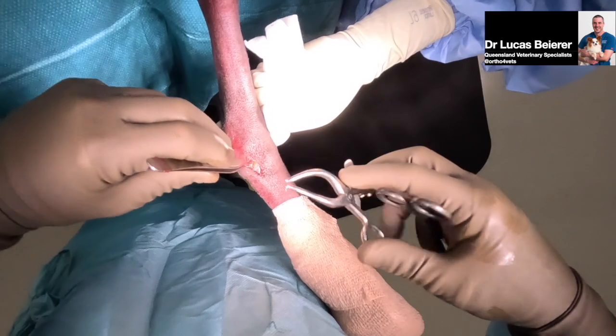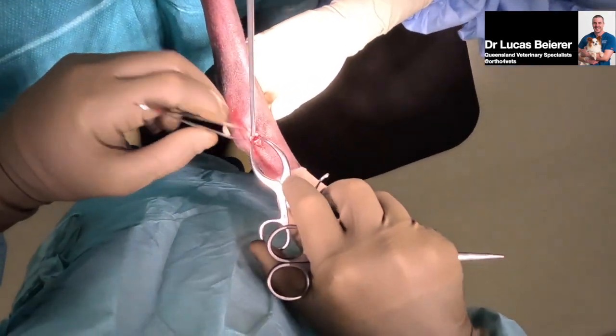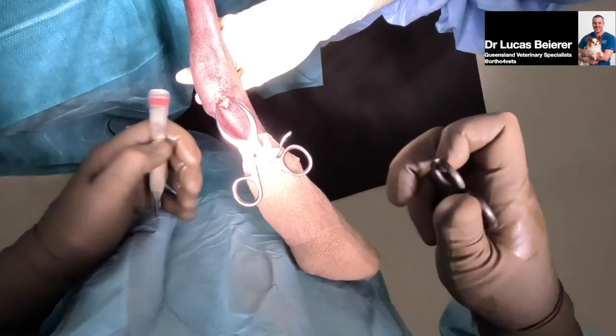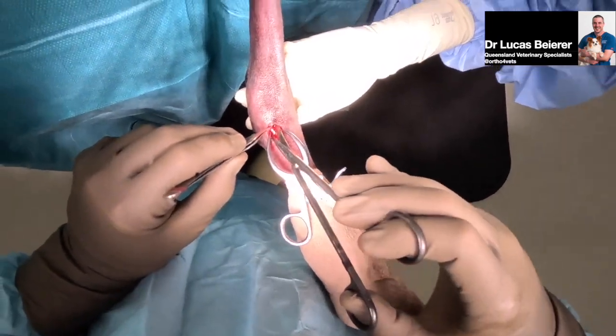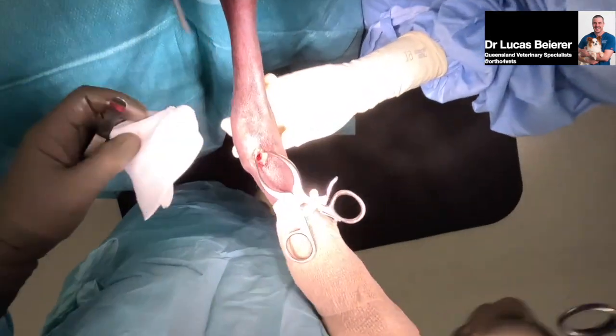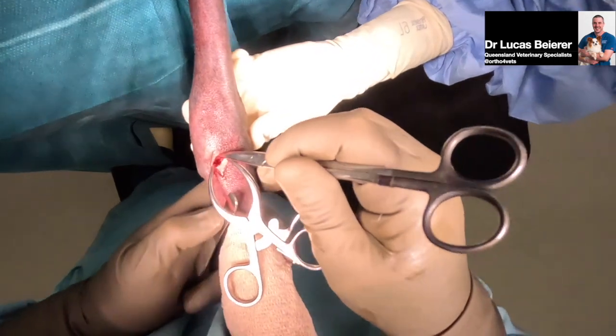So there is a little tendon that runs over the top of it that it would be nice to protect if we can. This dog's not going back to a racing future. It's going back to be the pet that it was when it injured itself. Hopefully slightly smarter.